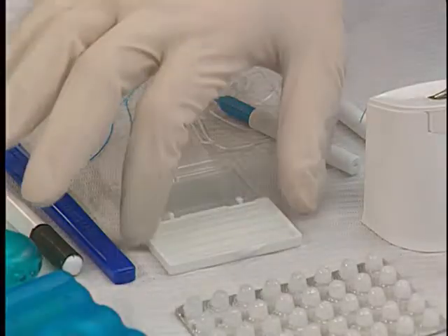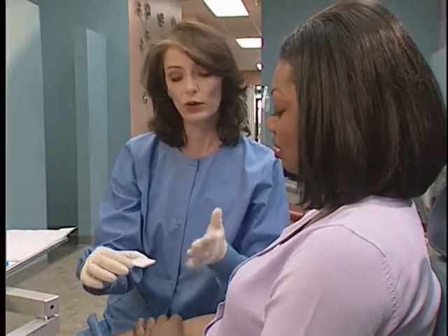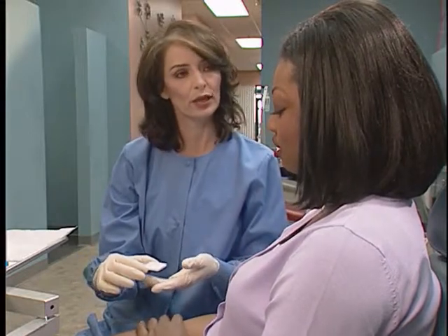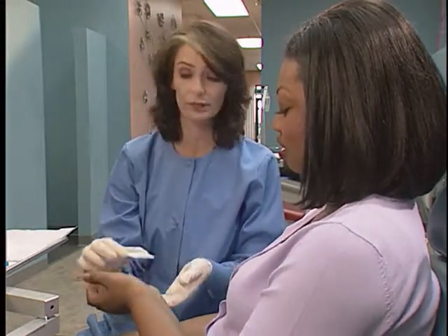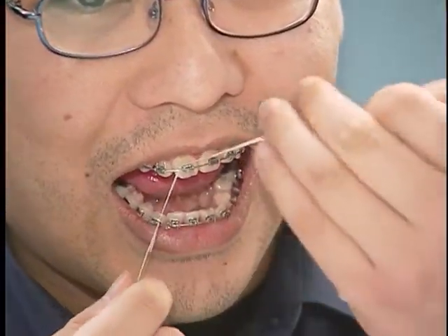And here, you need to take this along too. It's orthodontic wax. If you have any spots that are irritated by a bracket or a wire that's poking, just put a small piece over that spot. You can find these in the oral hygiene department at the drugstore or the discount store. Remember, as an active partner in your orthodontic treatment, your actions have a direct effect on the results you achieve.